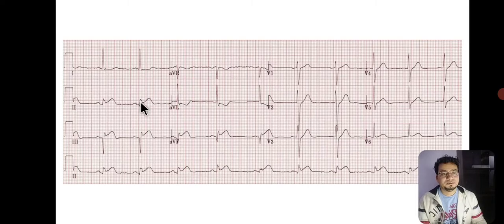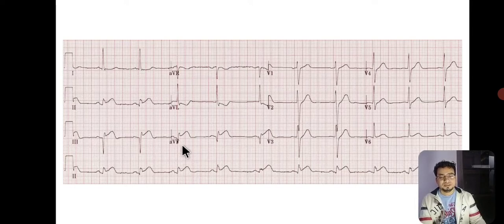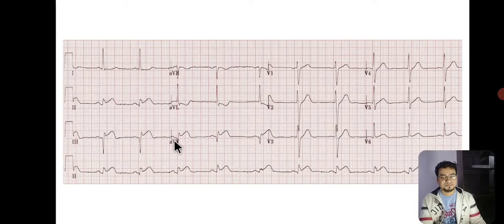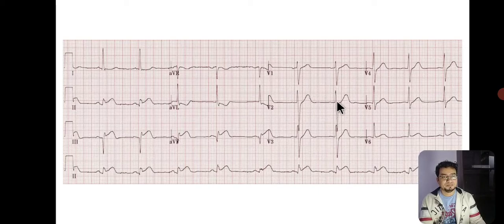Another example shows ST elevation in leads 2, 3, and AVF — this is probably inferior wall MI, because inferior wall MI presents with ST elevation in leads 2, 3, and AVF. The heart rate appears low: 300 divided by 5.5 large boxes gives approximately 54 per minute — sinus bradycardia.